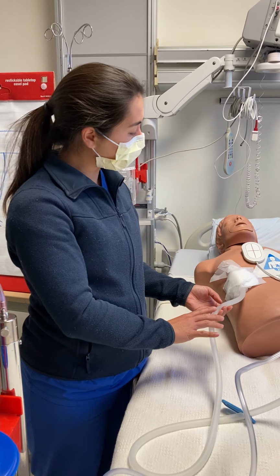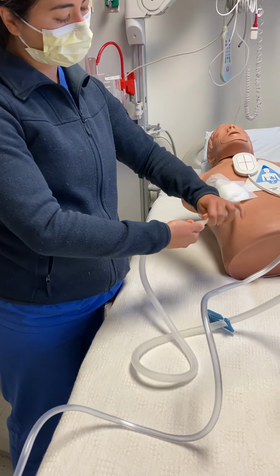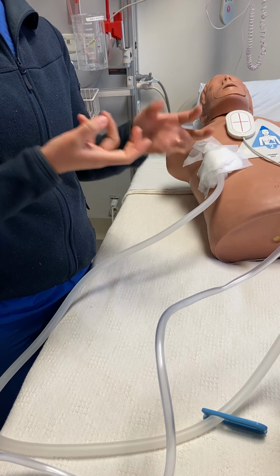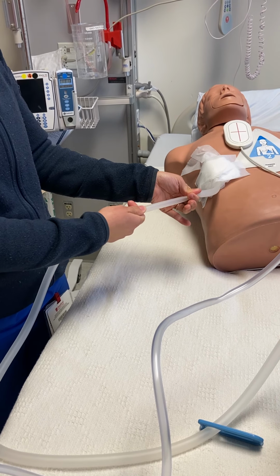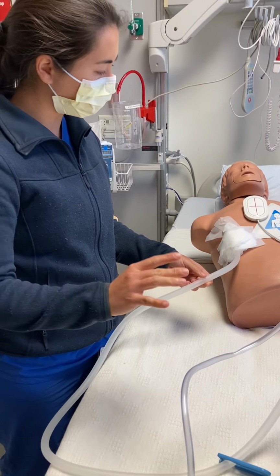If we do have someone who's had a decortication and they have a clot, what you can do is twist the tube and break up the clot. And I believe we've shown some of you how to milk the tube before. I would put on gloves, put a couple pumps of hand sanitizer on to give you some lubrication, and you basically pull the tube and let go. That creates a momentary increase in suction that helps break up that clot and drag it down.